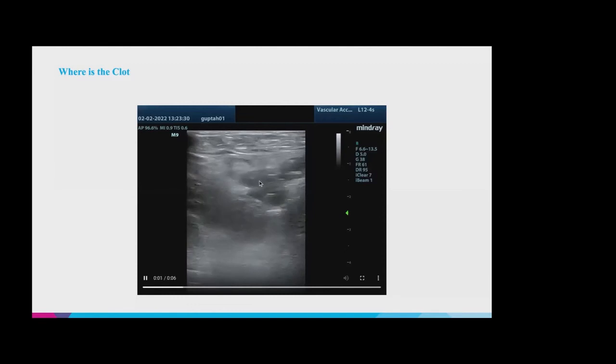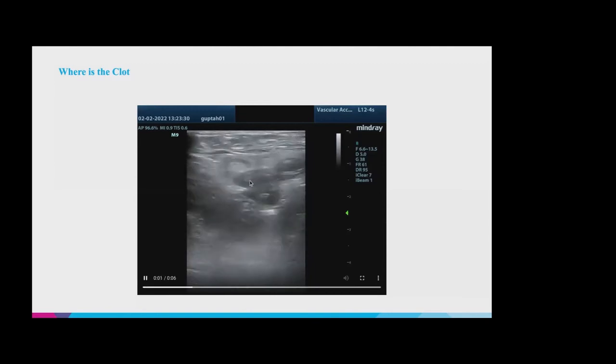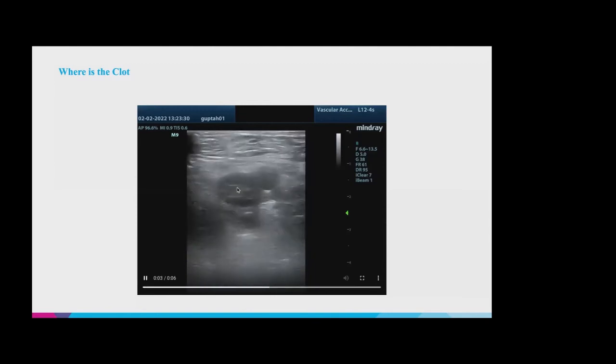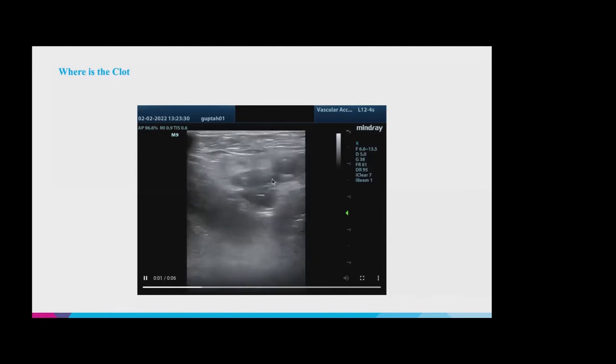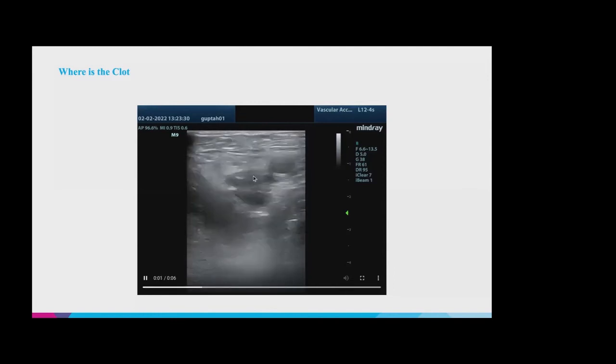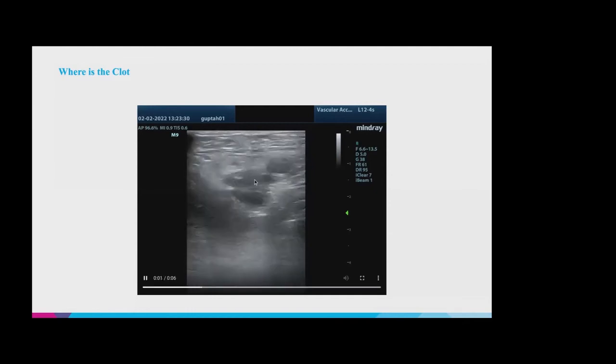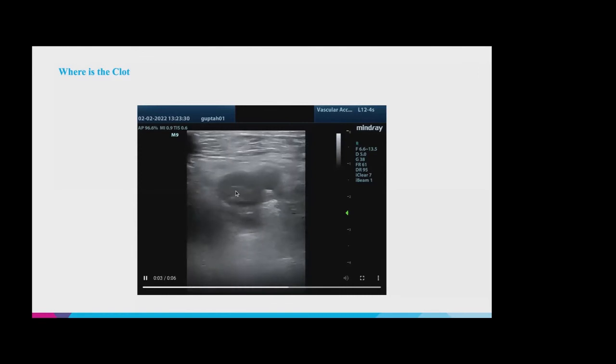That looks like a valve. So a valve will be very thin. It'll be literally just a very thin, slender line, whereas here there's something thicker. It's taking up a good amount of the vein. The one thing I will say is the person getting these images is definitely compressing too hard, and it's making me a little nervous because the arteries are getting completely compressed, and there is something here. If you compress too hard, you might dislodge whatever's here. But this is another example of a DVT, actually.